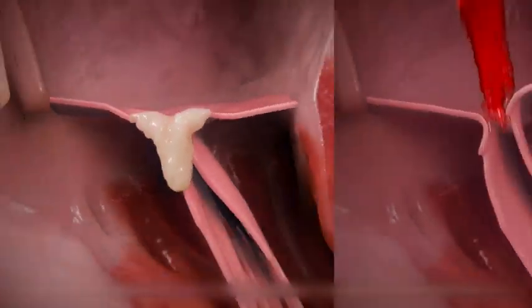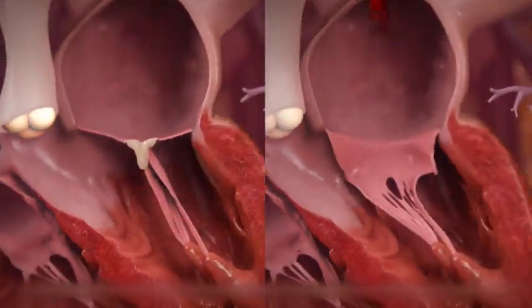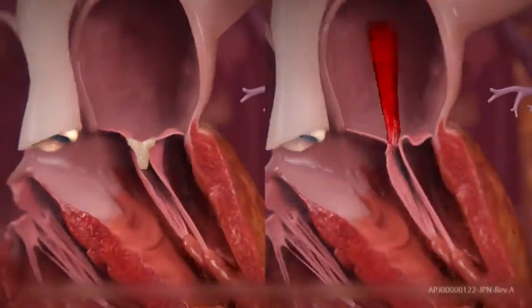The MitraClip procedure is a minimally invasive, highly effective treatment option for select patients with severe MR.